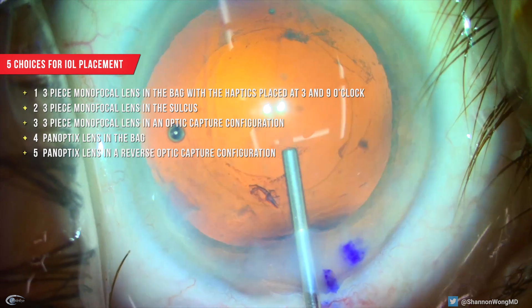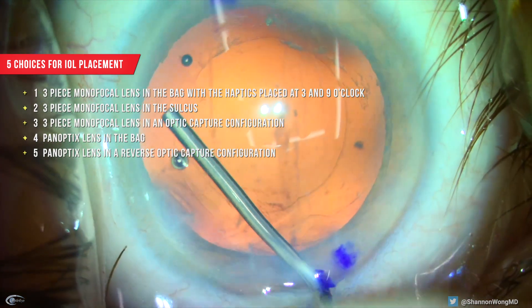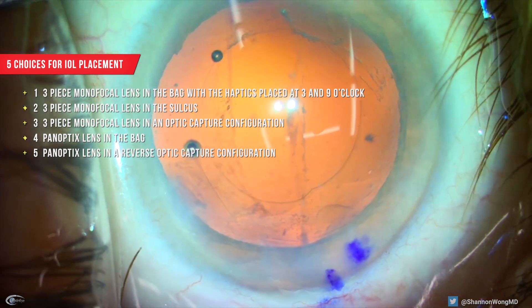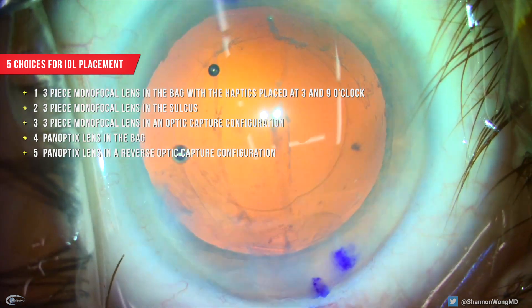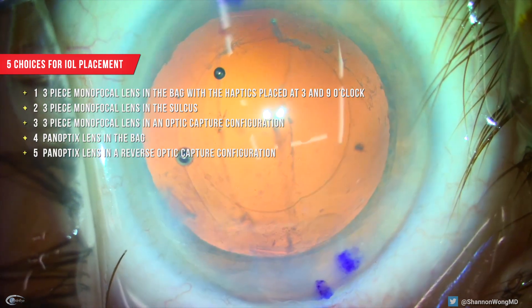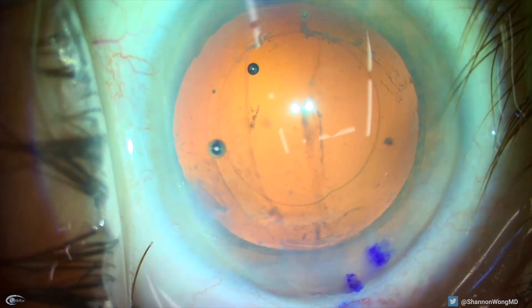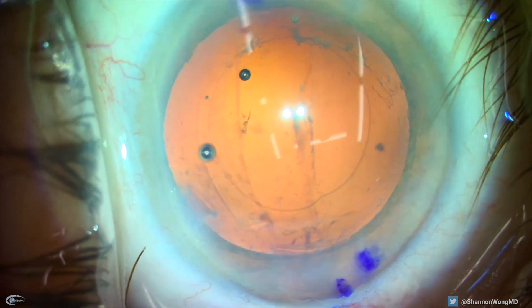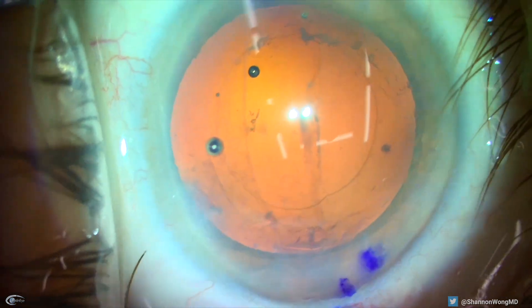Number four, a PanOptix lens can be placed into the capsular bag. Or number five, a PanOptix lens can be placed in a reverse optic capture configuration where the haptics are in the bag and the optic is prolapsed anterior to the anterior capsulorhexis, which is about five millimeters in diameter. We choose option four: placement of the PanOptix lens into the bag.